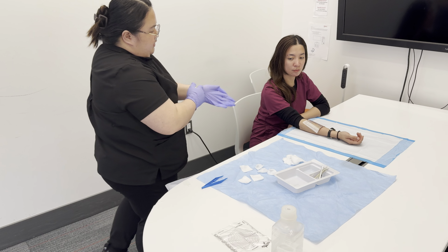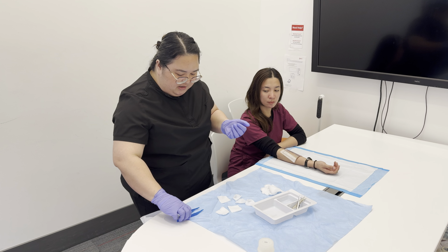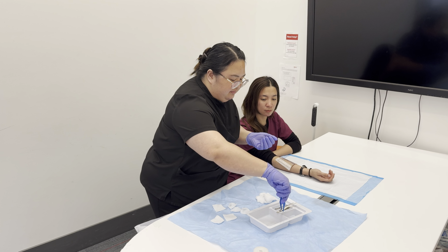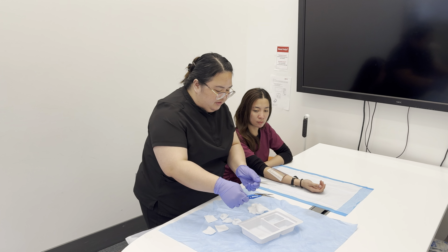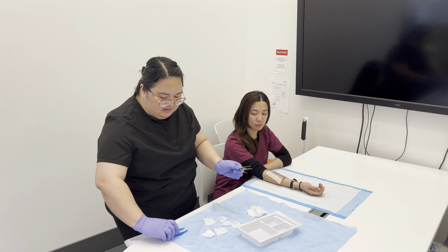Then I will now proceed to cleaning the wound by picking up the forceps, maintaining the 1-inch border, and we'll get the metal forceps and another one, maintaining the 1-inch border again.